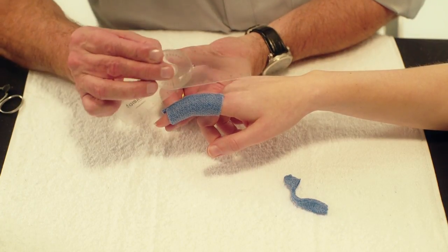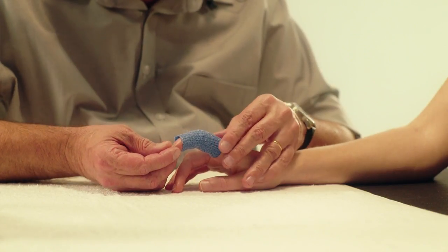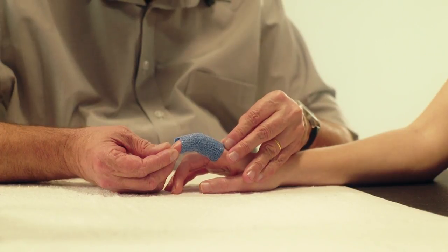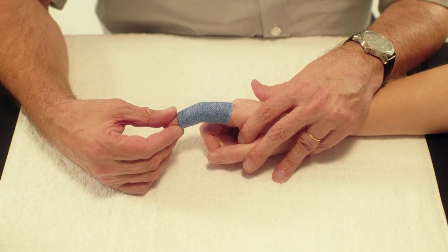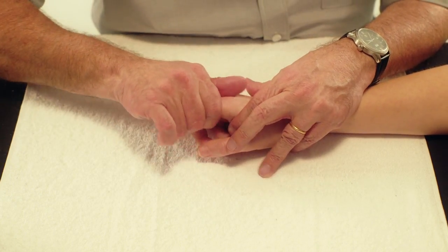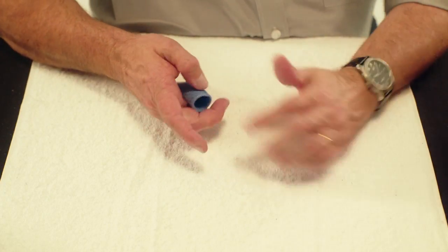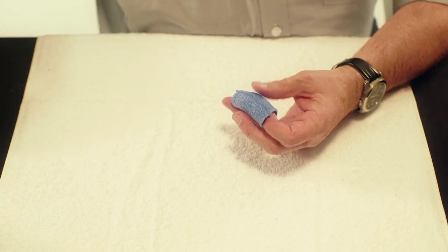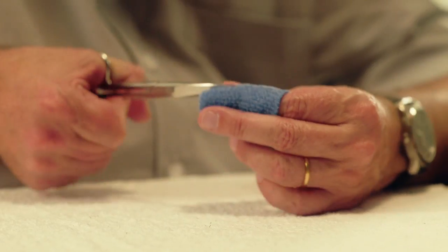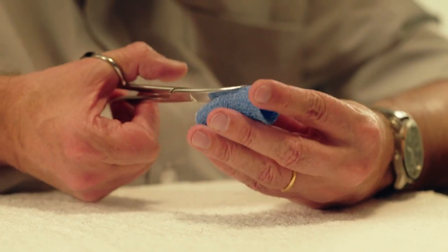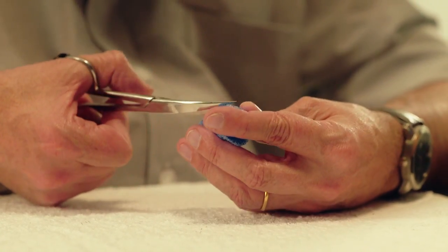Once the orthicast has hardened, remove it from the finger. Trim away the dorsal part of the PIP joint with scissors. Do this generously to allow full flexion.